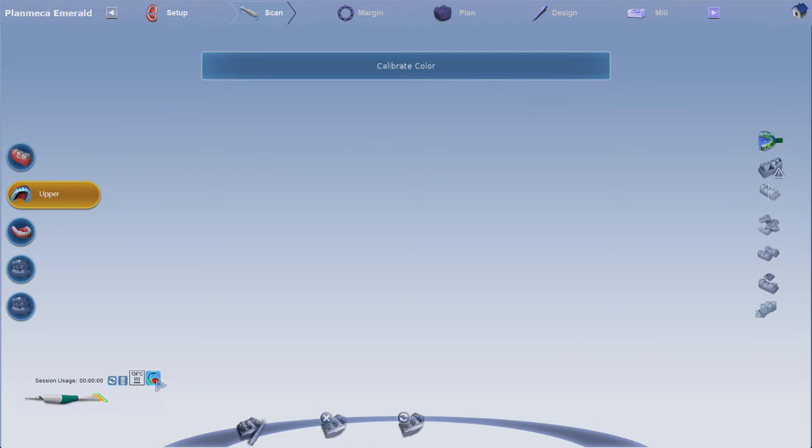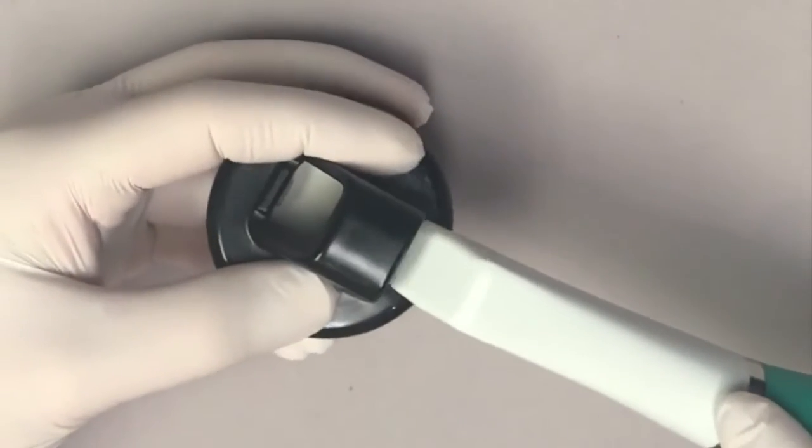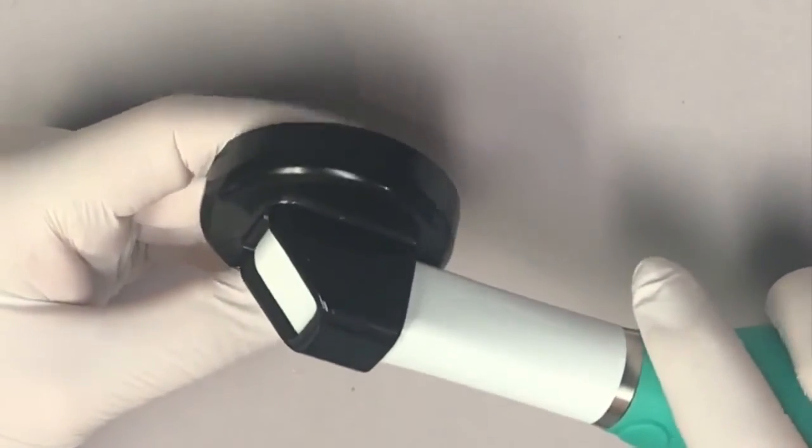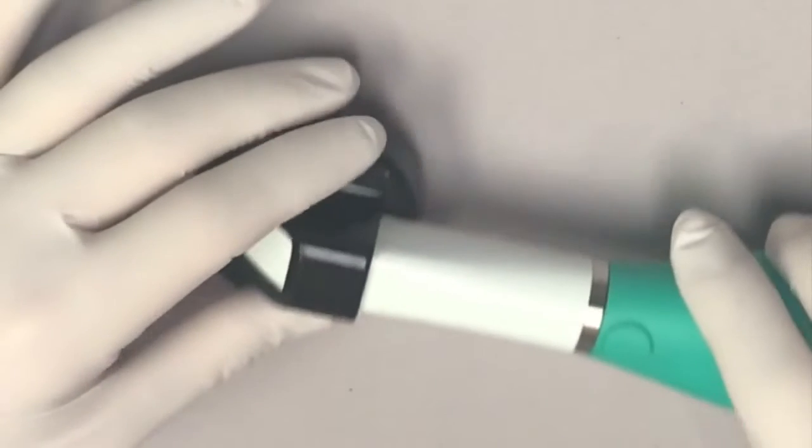Simply click on the color icon just above the scanner in the lower left, insert the scanner tip into the color balancer, then hit next.